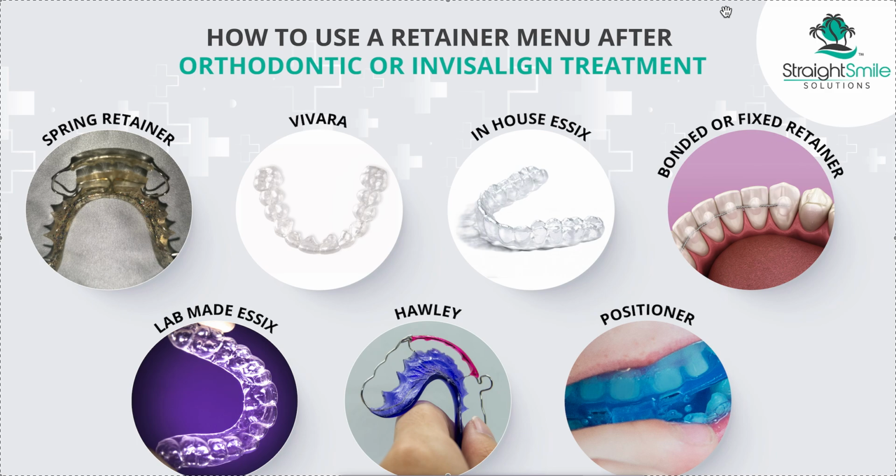Not everyone follows them, especially Invisalign patients who aren't used to having food rules and suddenly ask for a bonded retainer. It's like, whoa, what do you mean I can't eat this and that anymore? So I can eat a crispy taco? Maybe they can, maybe they can't. But you have to let them know that breakage can happen, shifting can be very rapid, and discomfort can happen.